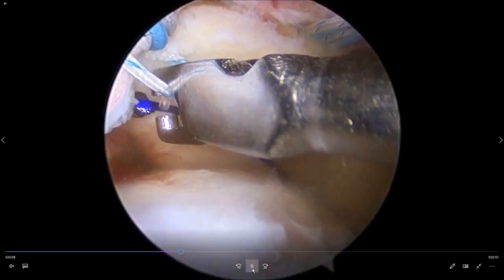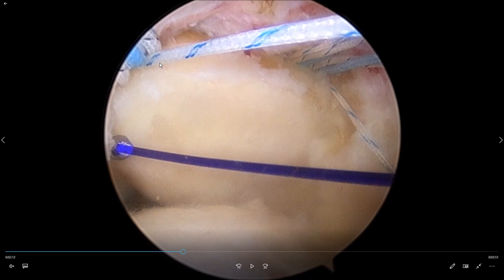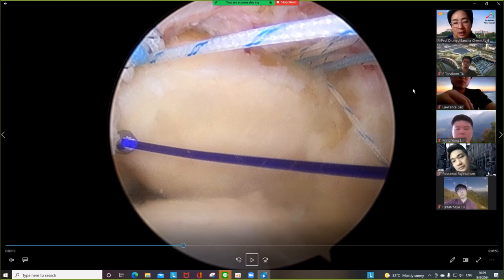I pass a suture for side-to-side first — one in the front, one in the back — and then pass the suture. Front and back you have a suture that when you pass the graft in it will spread more easily. Pass the suture first, because if you pass it later you cannot see it. I pass one in the front and one in the back. When you pass the graft in and tie it, it acts like a side-to-side — the graft will spread. When you grab gets inside you tie front, you tie back, the graft will be spread.